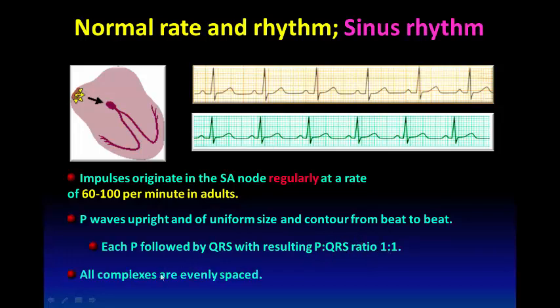And all complexes are evenly spaced. So the time interval between this P wave and the subsequent P wave and the subsequent P wave, these time intervals are equal.